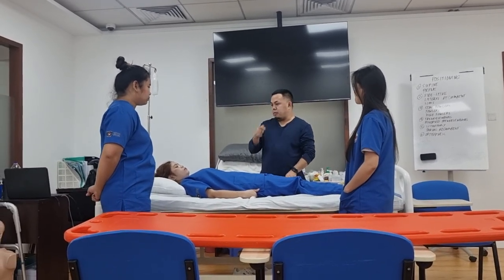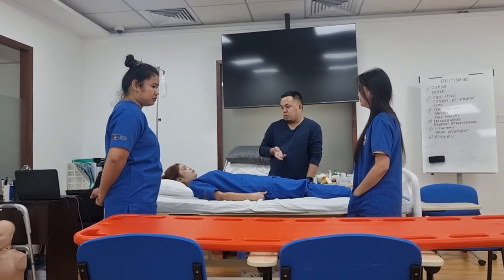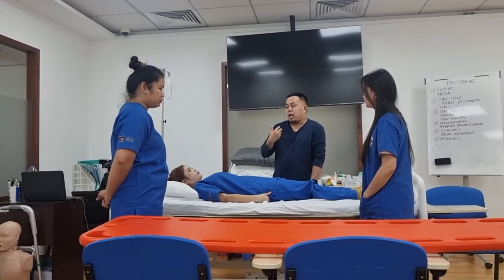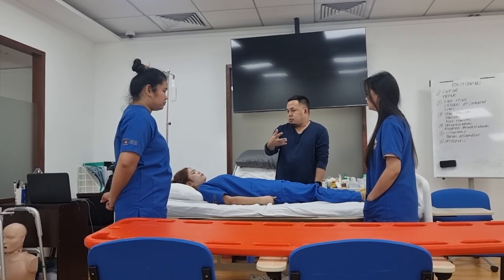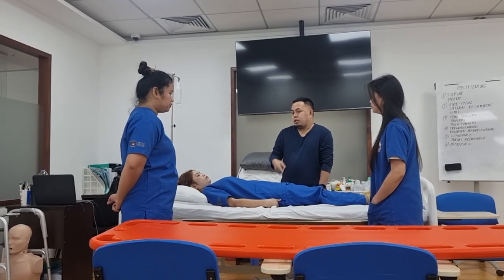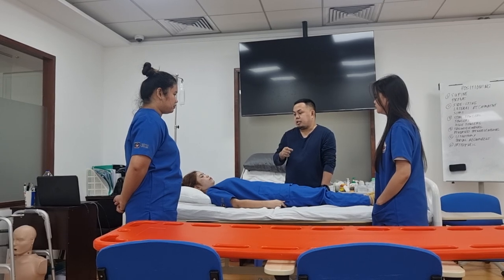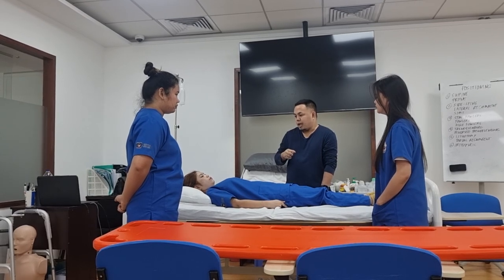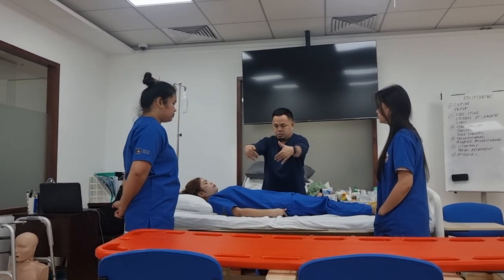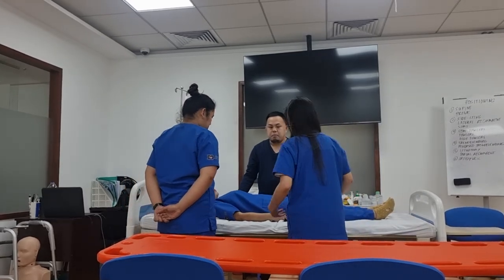Introduce the team: 'Ma'am, I have with me Jonah and Catherine — they are my colleagues and also nurse assistants. They will help me to transfer you from your bed to the stretcher bed, because you have a scheduled MRI today.' Then ask your colleague to stand ready to roll the patient.